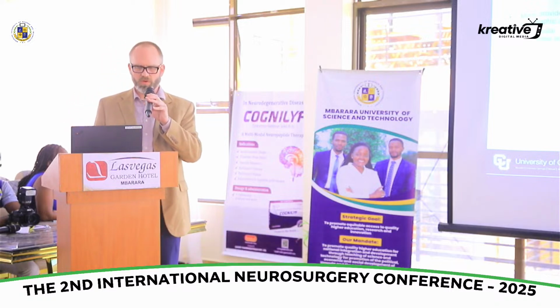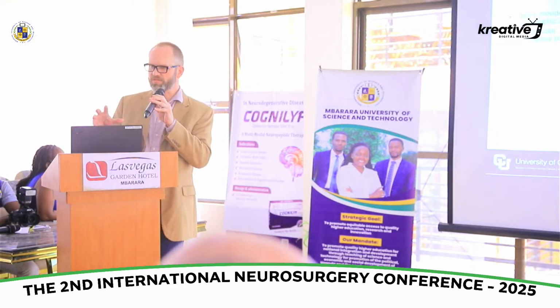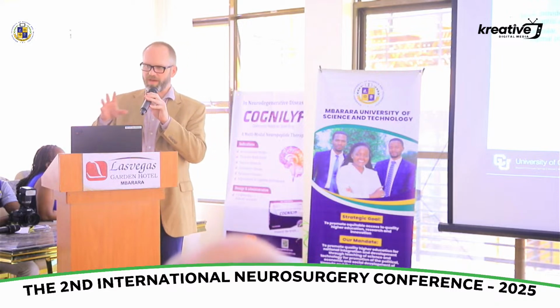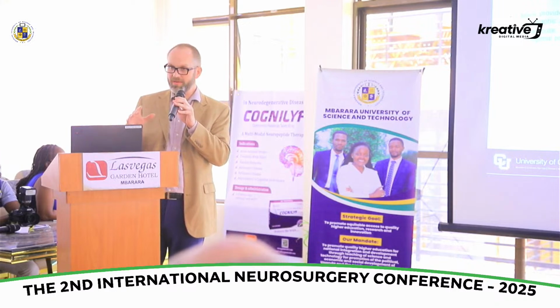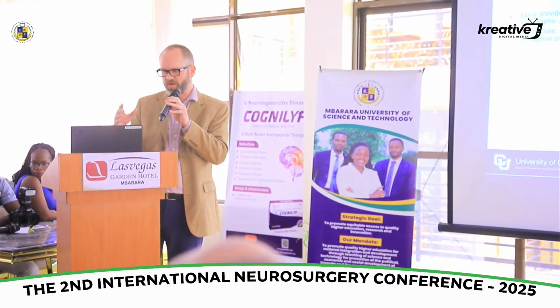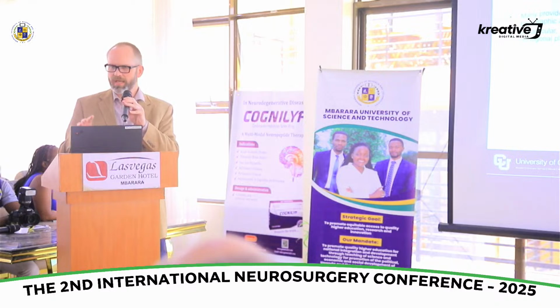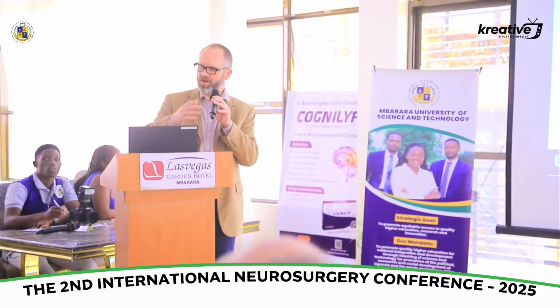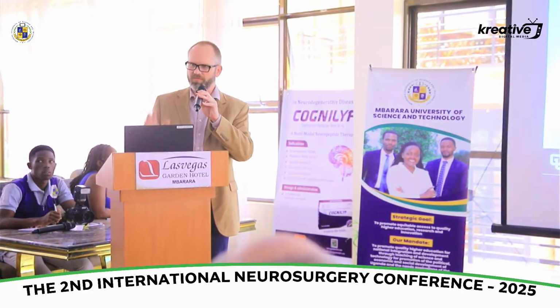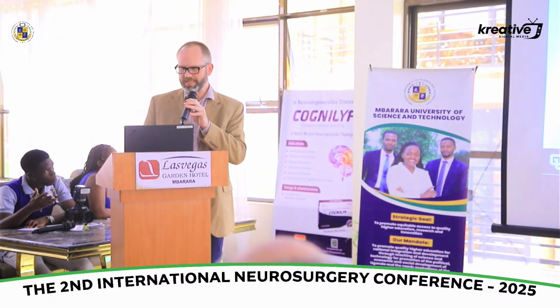We find for most people it takes about 40 to 50 cases for you to be really comfortable with the use of ultrasound. So don't give up too quickly. Bring it in, look at it, use what you can, and what you can't understand, just move on and operate as you normally would. There's a learning curve, and after you get about 40 to 50 cases under your belt, usually you get much better. And if you start with those easier lesions on the left side of that graph that we showed before, and then move forward to other lesions, it gets easier.